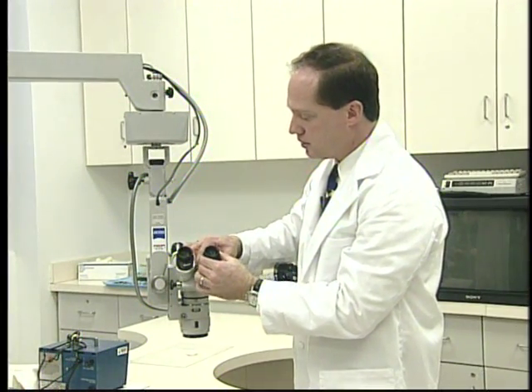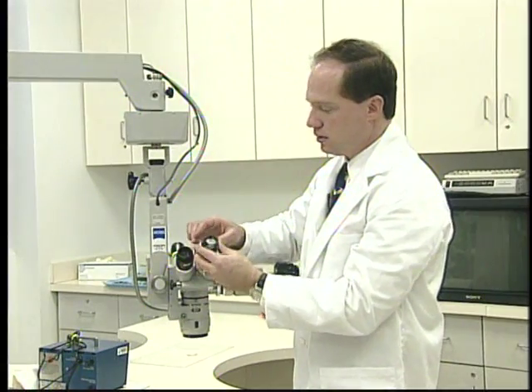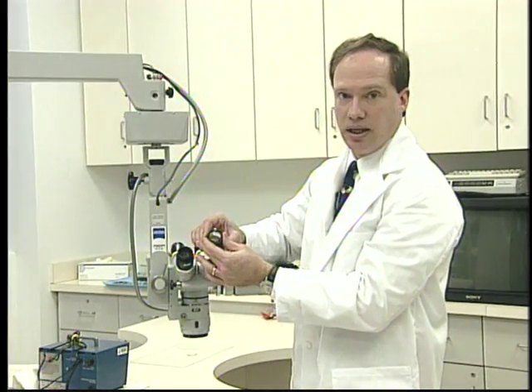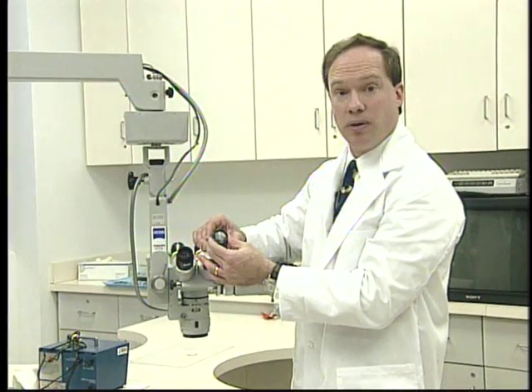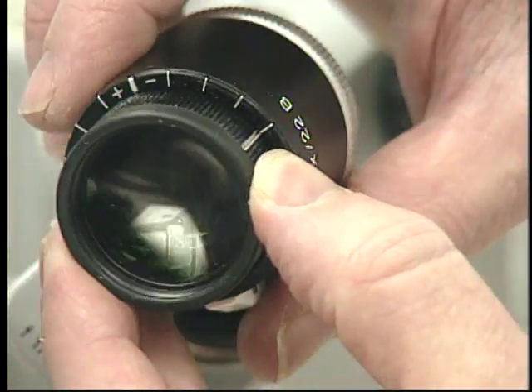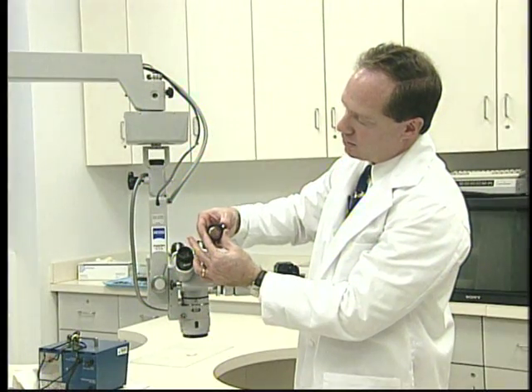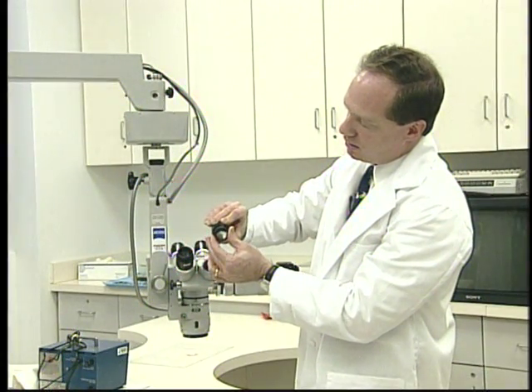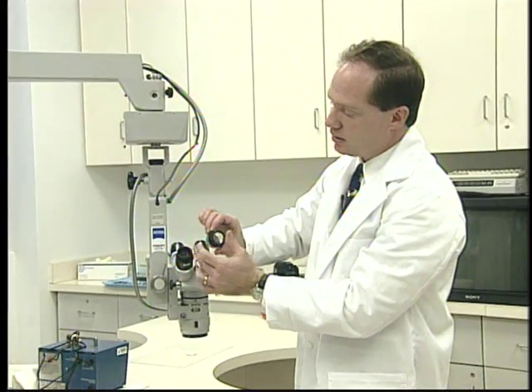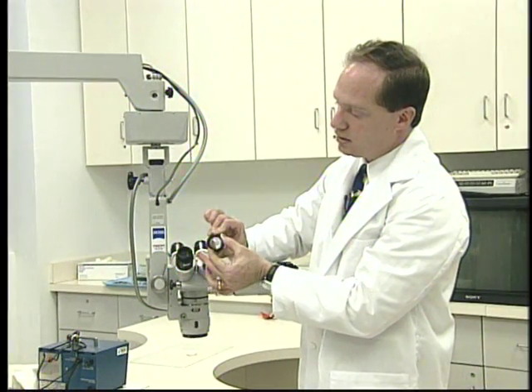Now the eyepieces are usually also detachable, and these, you will notice, have a little ring to rotate. Now this is so that you can focus and take into account any differences in the refractive properties of your two eyes. If you happen to be 20/20 in each eye, then you would want to set this for a setting of 0. Sometimes there is no 0, there's just a little line with plus and minus, and you can rotate the white line to that after you've screwed it in all the way to make sure it's set at the maximum inset length, and then you put it in the neutral position. What you would want to do then is to look through each eye, close one eye at a time, and focus so that it's in the correct focusing position for each eye.